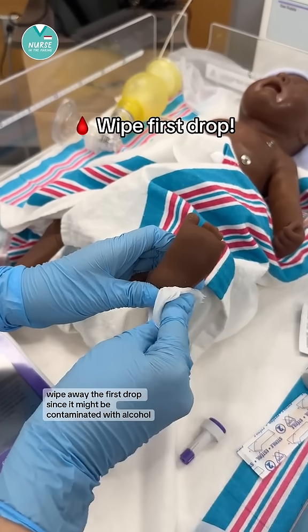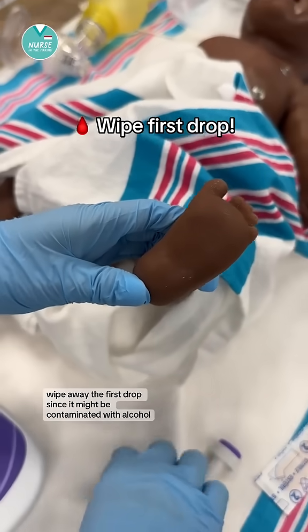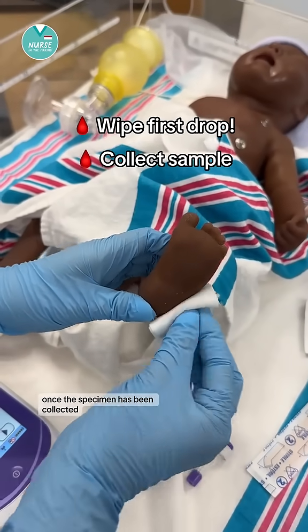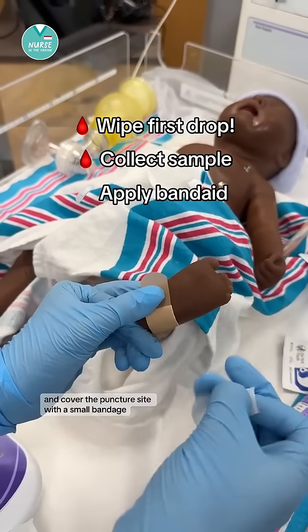To collect the drop of blood, wipe away the first drop since it might be contaminated with alcohol. Once the specimen has been collected, you can apply gentle pressure with a gauze and cover the puncture site with a small bandage.